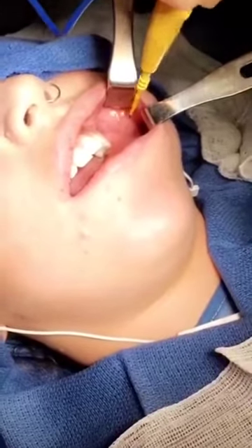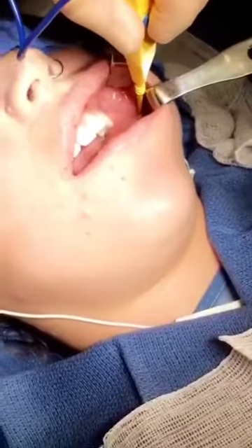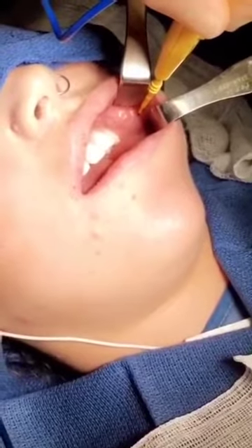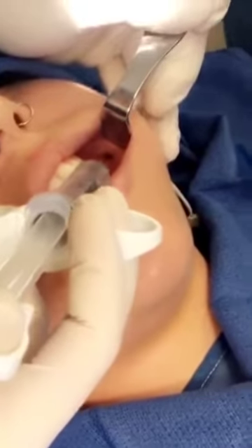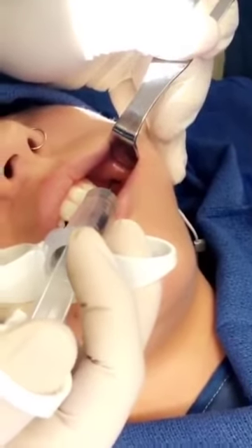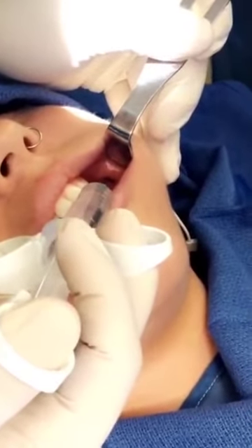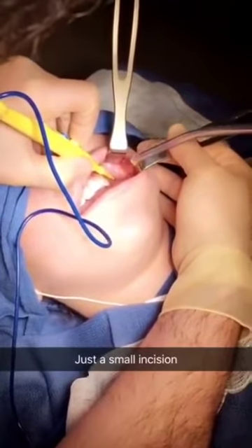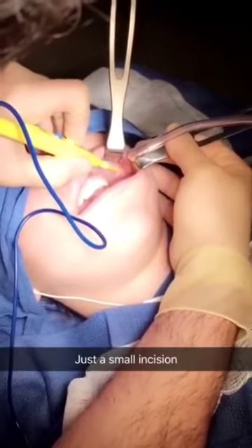This is her parotid duct. This white line is called the bite line. I'm going to make an incision right in between them. Just a little incision — here we go.